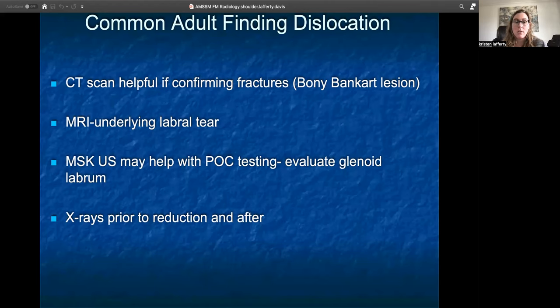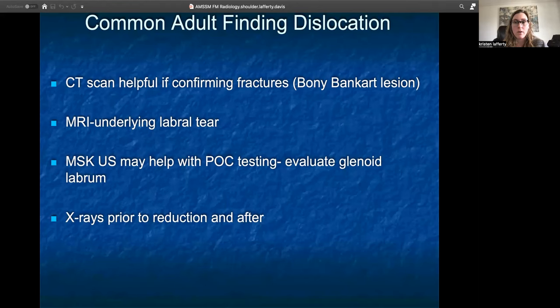Musculoskeletal ultrasound is helpful with point-of-care testing. You can look at the glenoid, sometimes see the labrum well on smaller patients, and also check your rotator cuff tendons. The most important thing to remember is that x-rays are really important both prior to and after reduction of a dislocation — to make sure you achieved the results, but also to look for any fracture fragments that you might find within the joint, which could be an issue. Definitely want to take a good look at those x-rays pre and post.